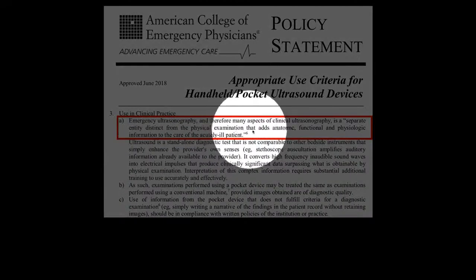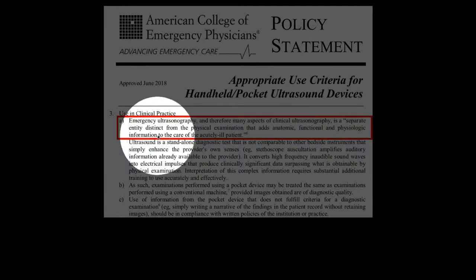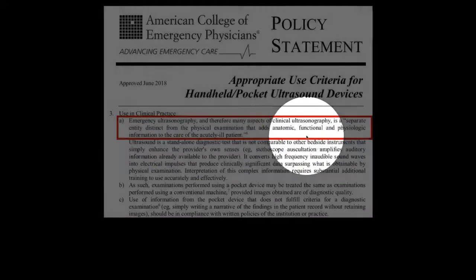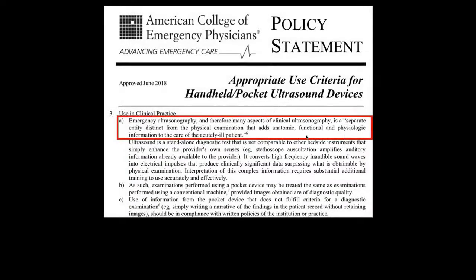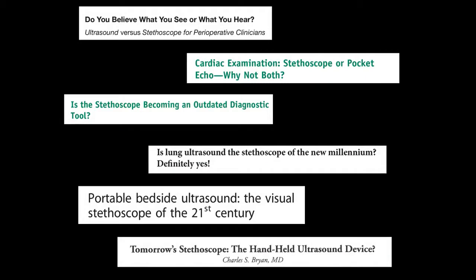Now, when you're talking about ultrasound, you're also talking about the clinical examination. You're trying to make sure that you're not saying that this is part of your physical examination. Unfortunately, all the studies that Shikhar just talked about, even in medical students, are saying this, popping out everywhere: this is part of the physical exam, this is part of the ultrasound. Why would I actually even pay for that? There's no reason for it.